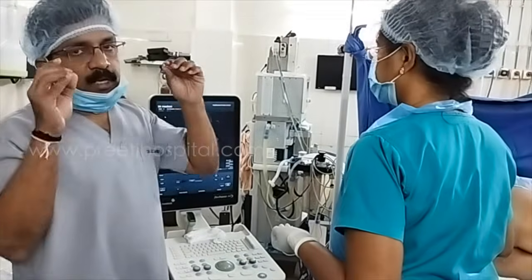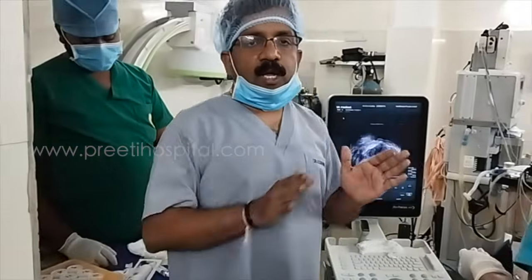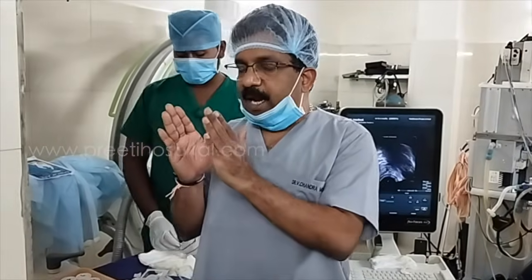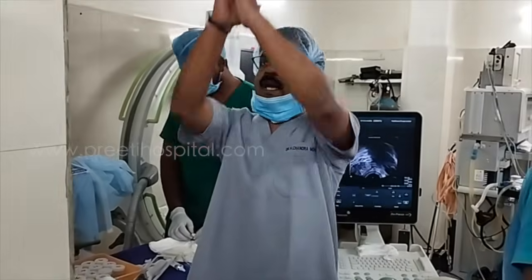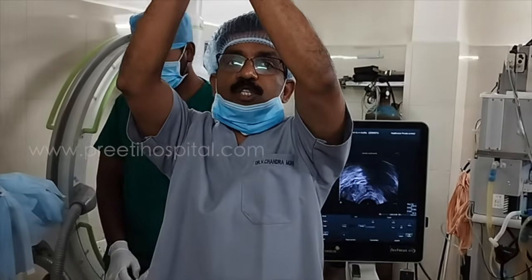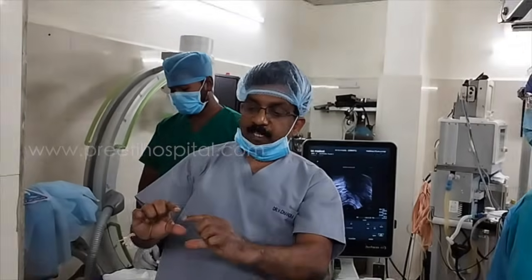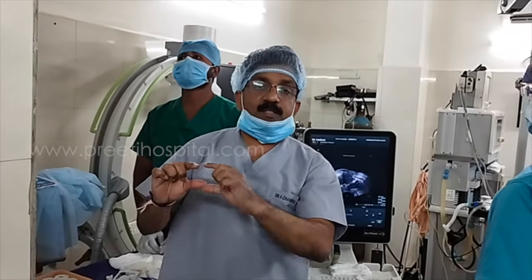So very clearly, we have three options here. One is axial. In axial, you will see directly towards the gland, where you go vertically up, where you can travel the transition zone and go to the anterior part. For example, this is the anterior part, this is the posterior part. The entire length can be traveled, but the periphery of the tumor is very less.